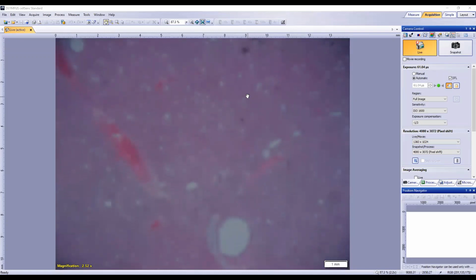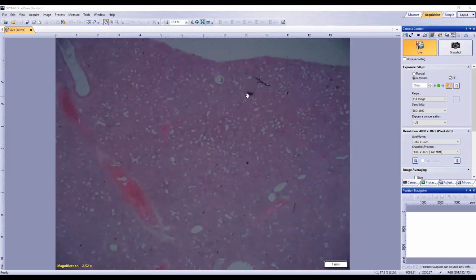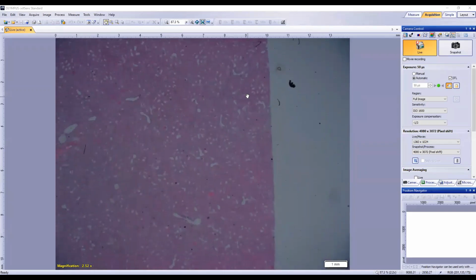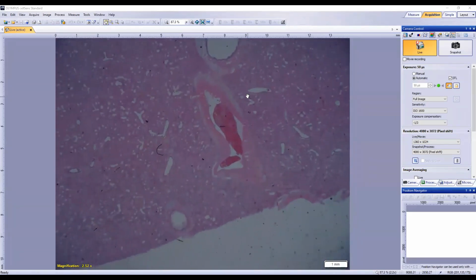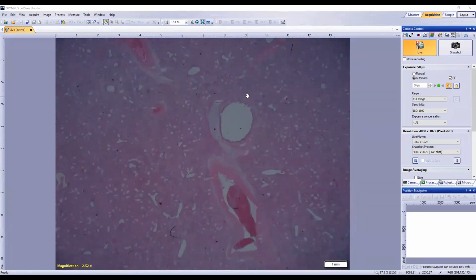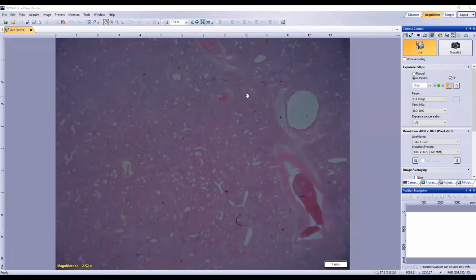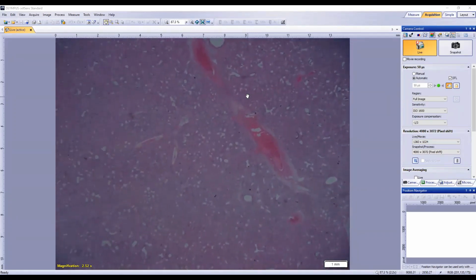Cool. So let's start out on the pleura, just because that's where we were a second ago. And yep, pretty boring. So that's firmly directing us towards an interstitial or a bronchointerstitial process. Right.